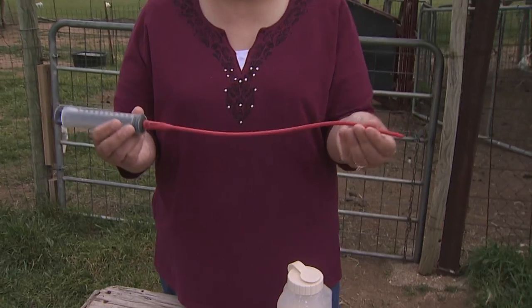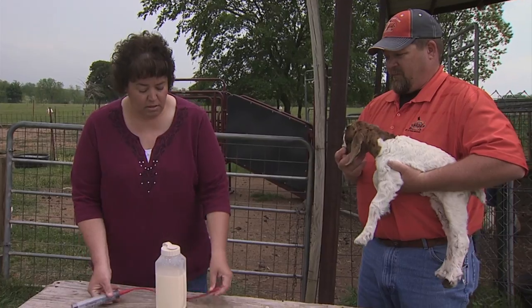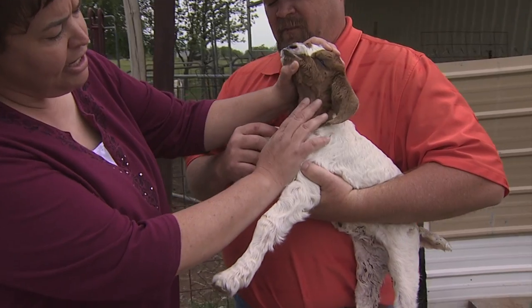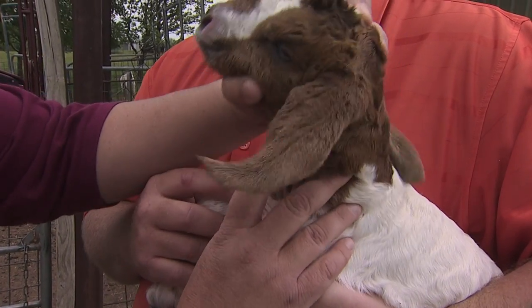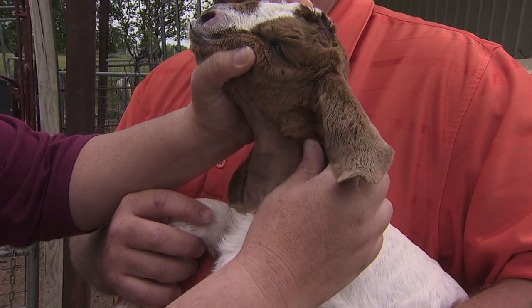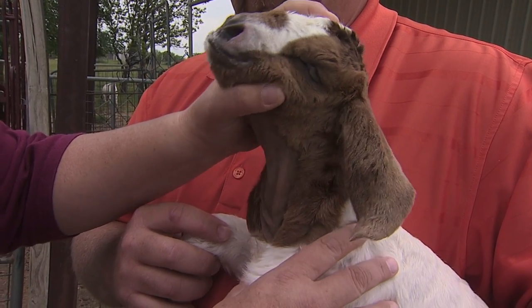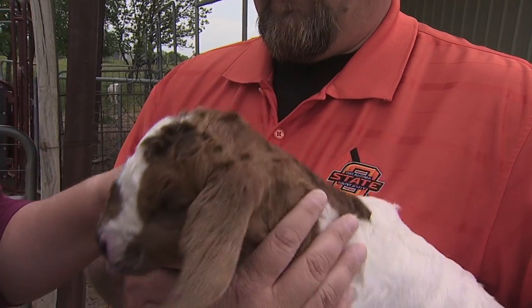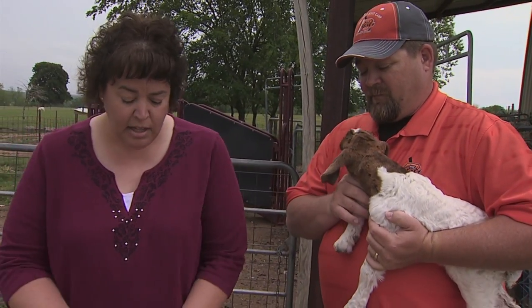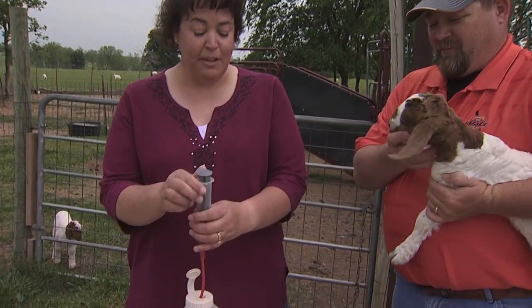What I'm going to do is put this tube down her throat and into her stomach. I have shaved her neck right here so you can see it a little easier when I get ready to put the tube in. You'll be able to see this under the hair as well, but for camera purposes this will be very advantageous. This little girl has some issues and she's just now learning how to use her tongue to suck, but she's been tubed several times.